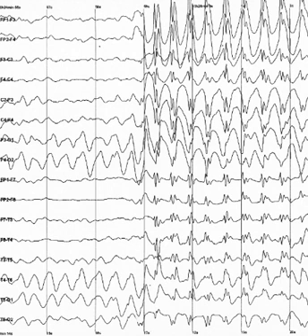Glossokinetic artifacts are caused by the potential difference between the base and the tip of the tongue. Minor tongue movements can contaminate the EEG, especially in Parkinsonian and tremor disorders.